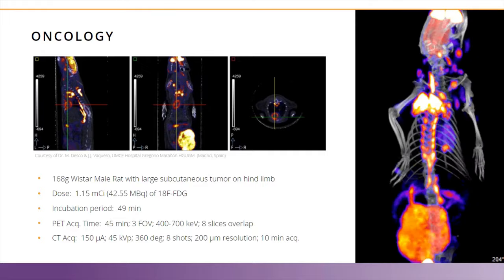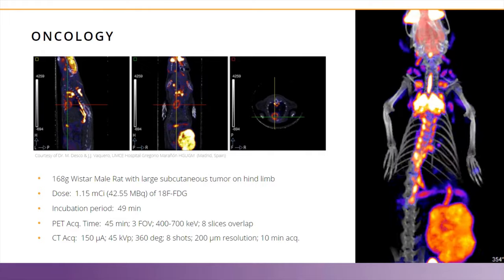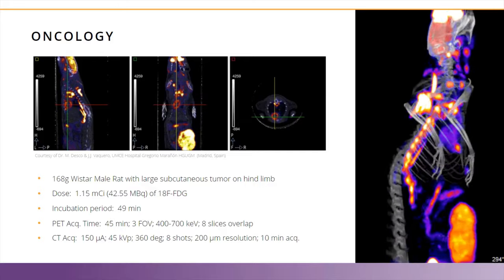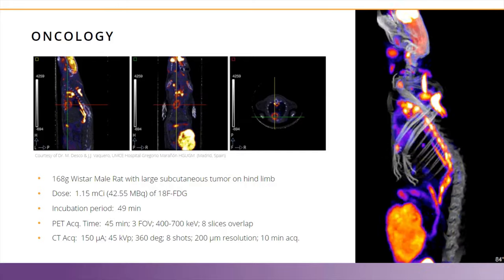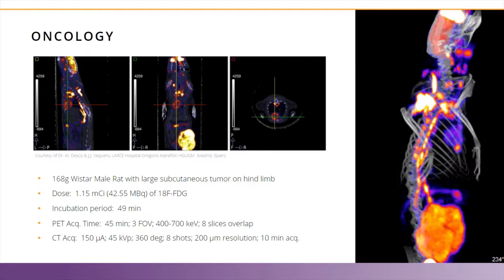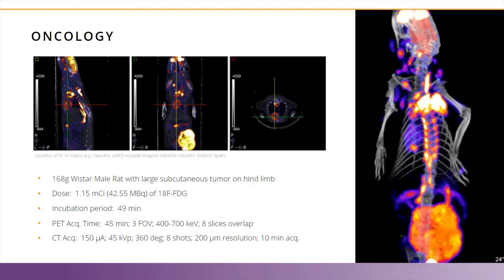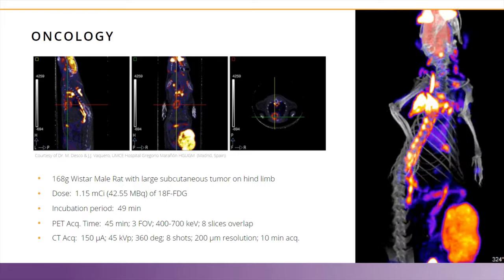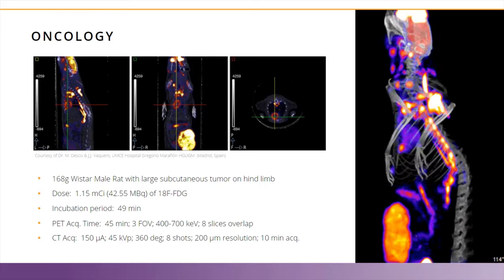When looking closely at the tumor, you can clearly see the areas of higher and lower metabolic activity based on the color scale within the image. These images are fully quantifiable and various regions of interest could be drawn. Here the CT image also provides us with some anatomical context for where the PET signal is located within the body of the animal.